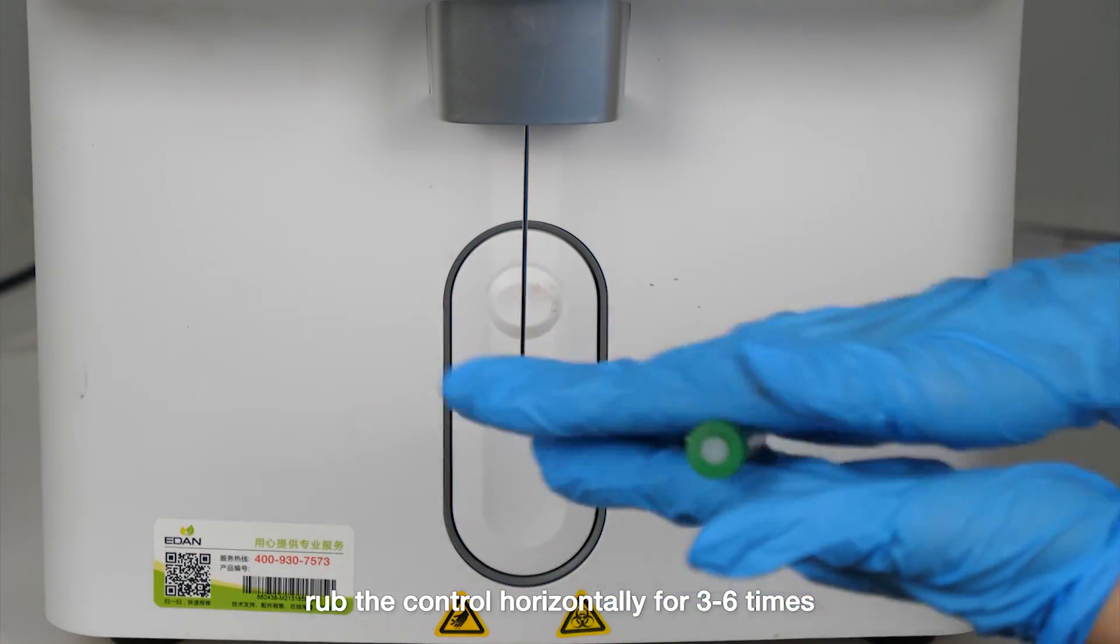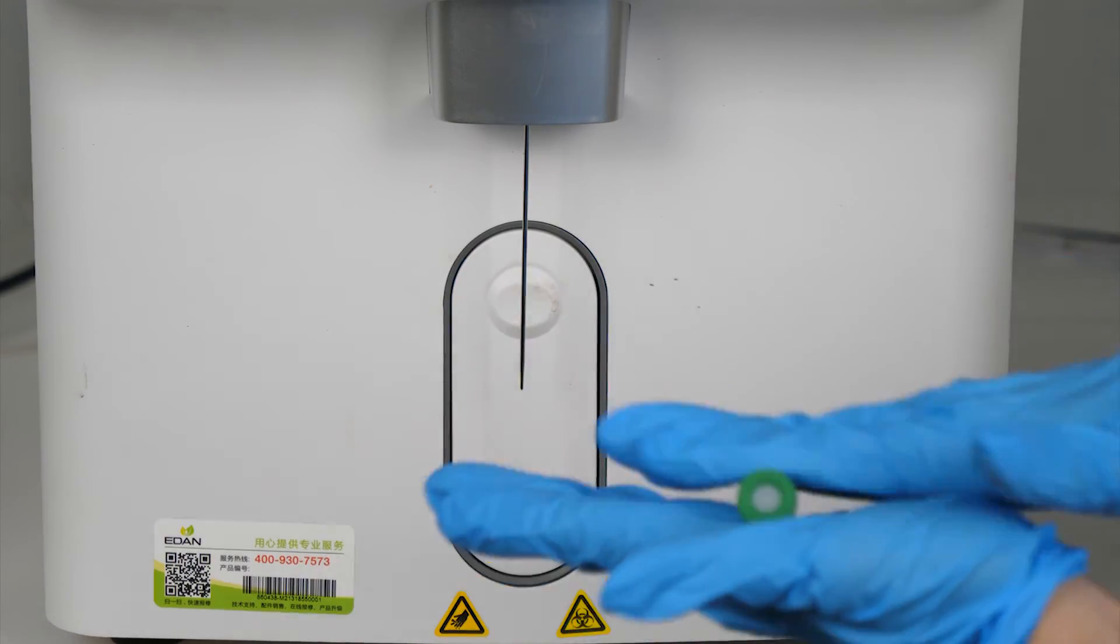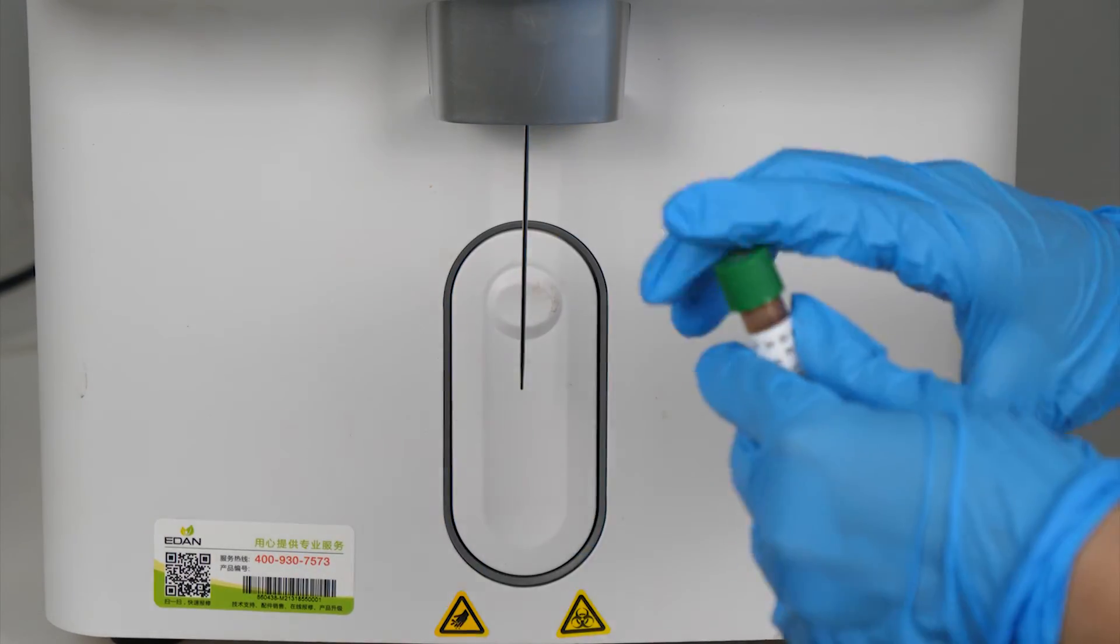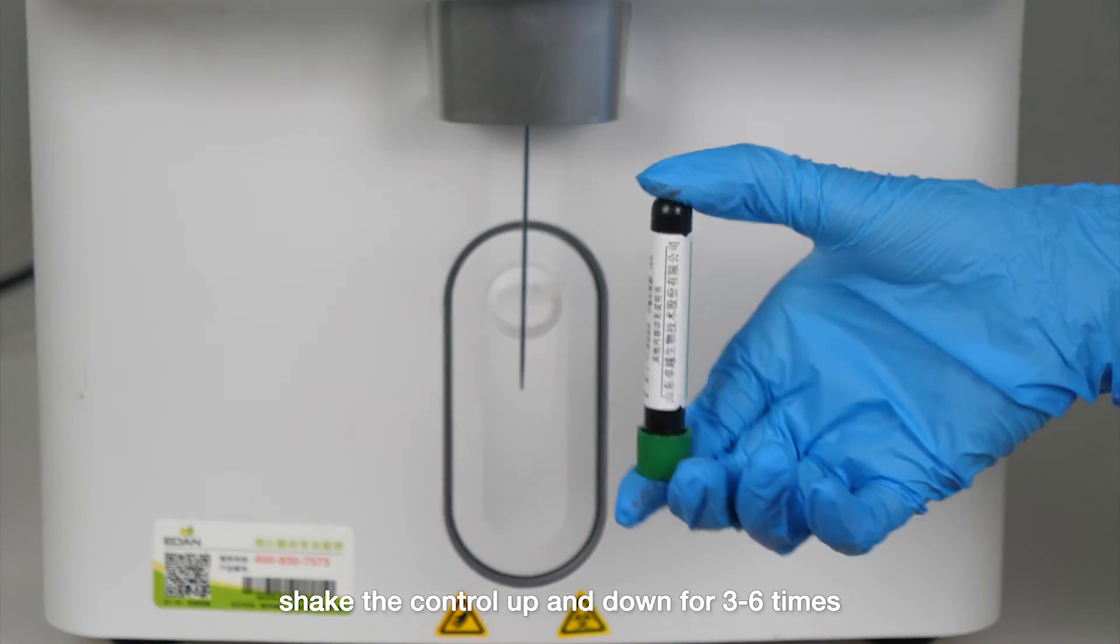Rub the control horizontally for 3 to 6 times. Shake the control up and down for 3 to 6 times.